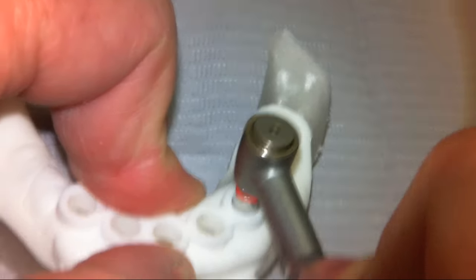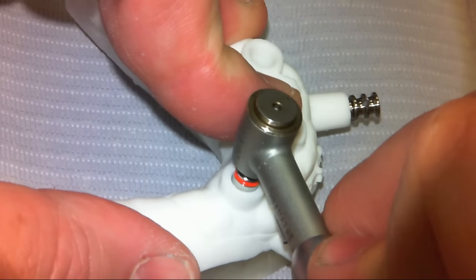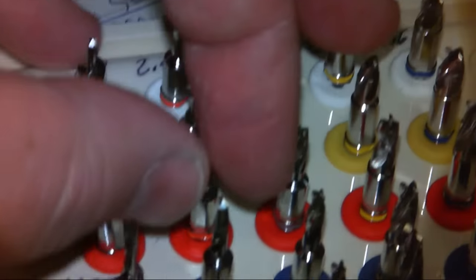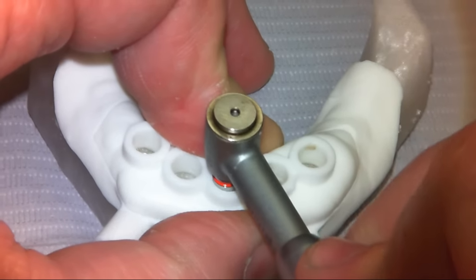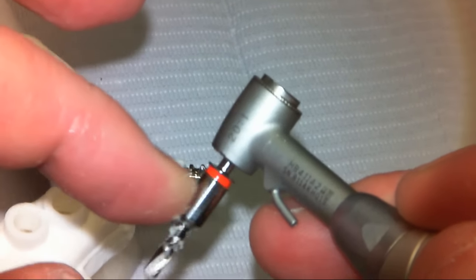So I'm going now and basically just going another 2mm deeper beyond that 6mm. We can take the guide off very simply. Now let's go to the 2.5 by 10mm — that will get us to our final length for the implants we'll be placing. And you can see I'm not generating any shavings on my guide despite having no metal stop, because it's just engaging this smooth surface — there's nothing here to eat it up.